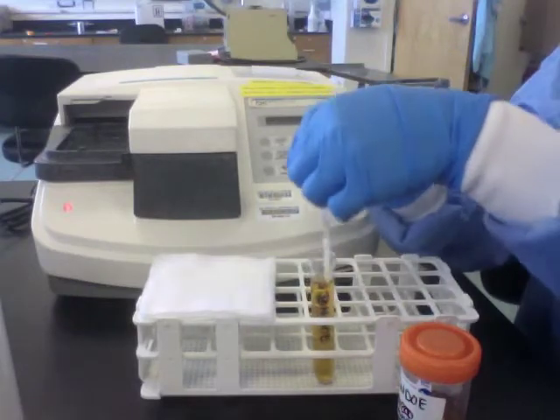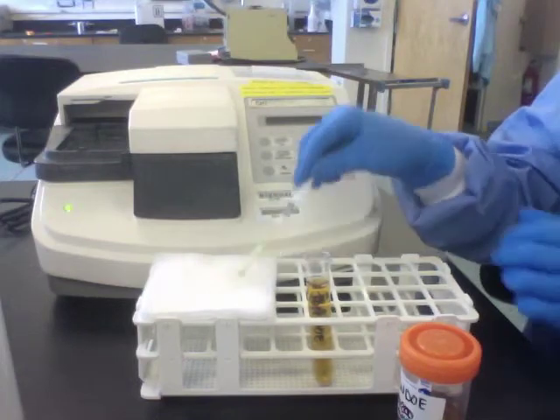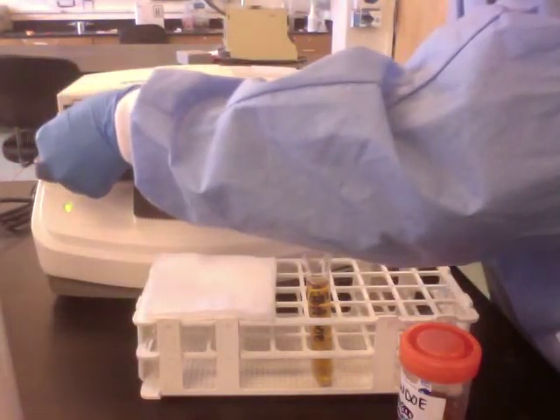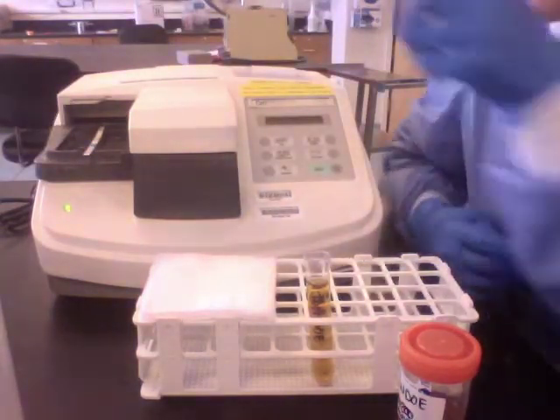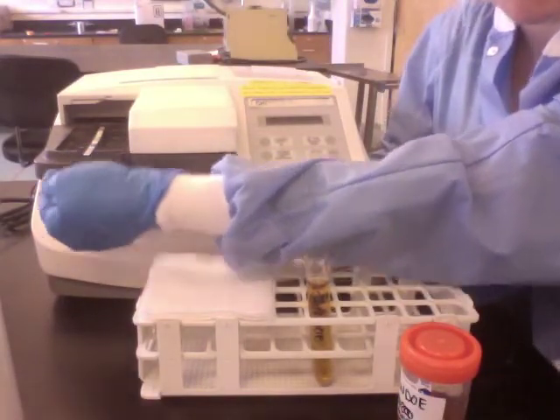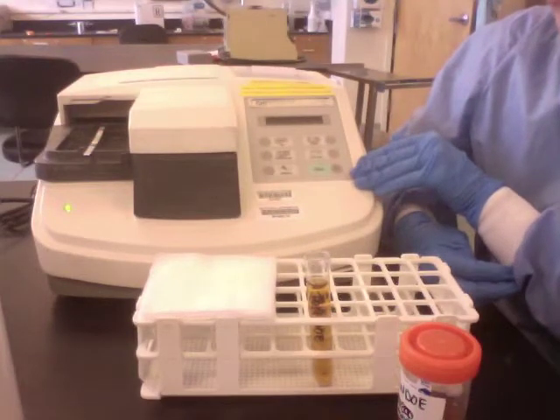Dip the strip quickly, withdraw, and dab, then insert the strip into the tray next to the notches — there are some little notches right here. It's going to be flush up against those notches. Now the machine tells you what to do.